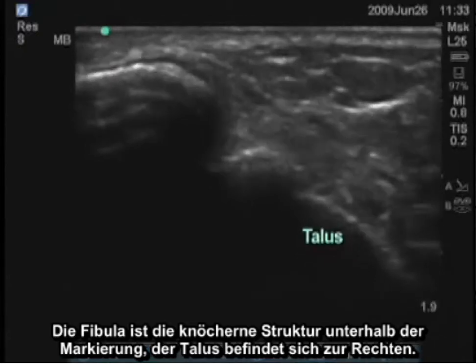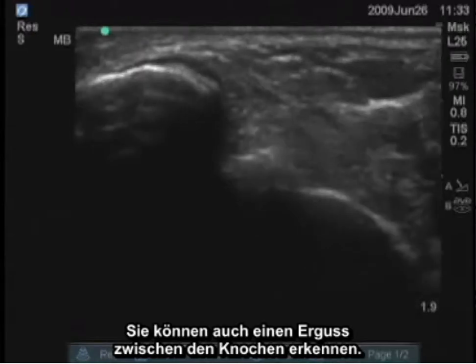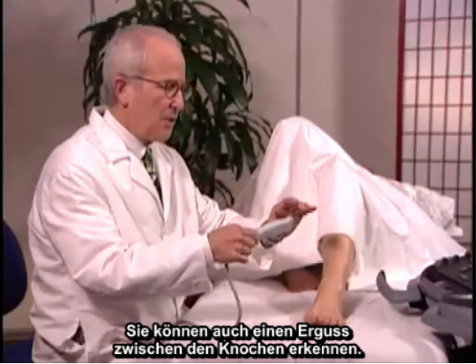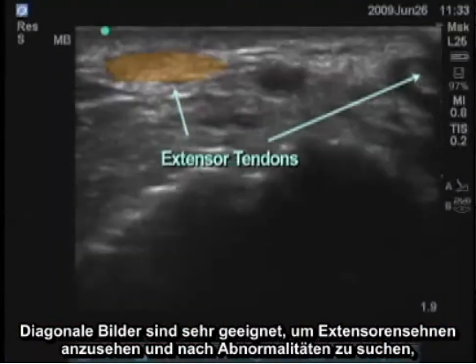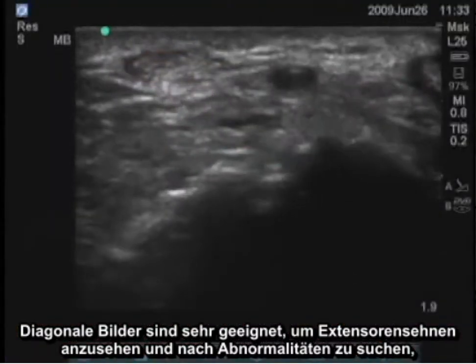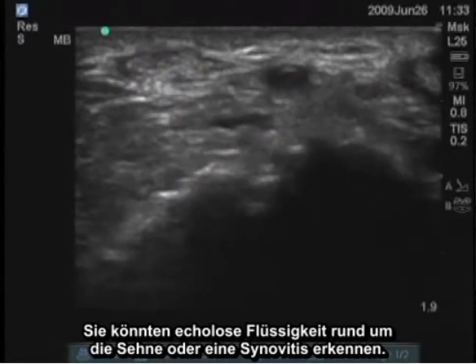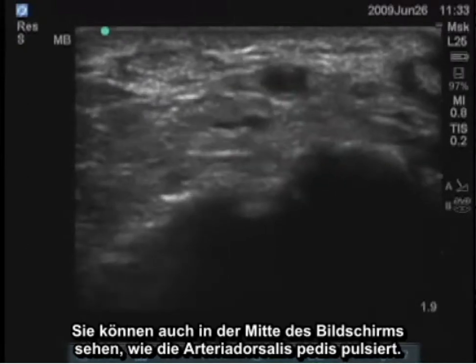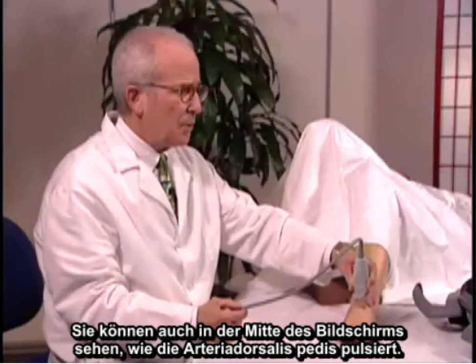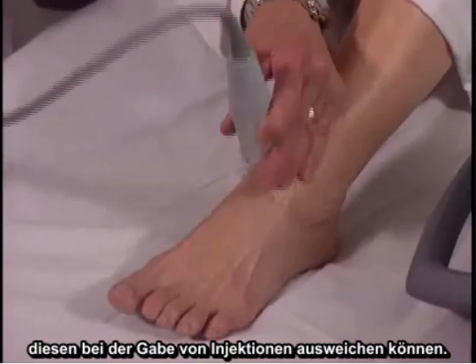The lateral aspect of the ankle joint can also be examined. The fibula is the bony structure underneath the marker, and the talus is to the right — you can see an effusion between those bones as well. Transverse images are very good for looking at extensor tendons and tendon abnormalities; you might see anechoic fluid around the tendon or synovitis. You can also see the dorsalis pedis artery pulsating in the middle of the screen. It's very important to identify artery positions to avoid them during injections.